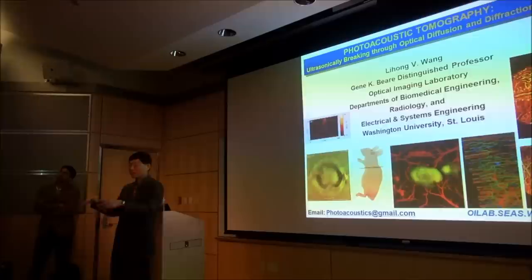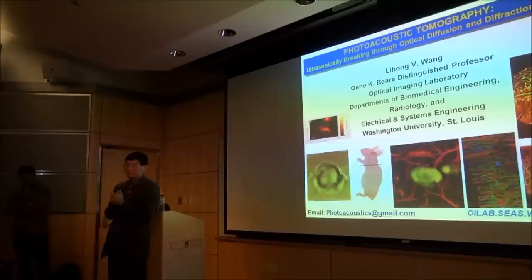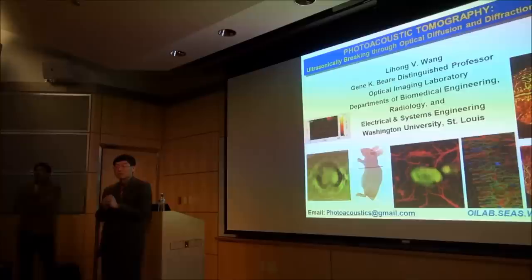And there are some other invasive methods. For example, you can insert a needle. Minimally invasive, but not terribly invasive, but still invasive. And that needle has a known absorption spectrum. So if you insert it, you can calibrate your fluence on a relative level between different wavelengths at every depth. So that's another way to deal with that issue. But it's not a finally solved problem yet. Our field is still working on that problem.